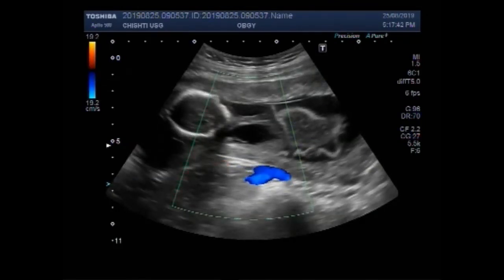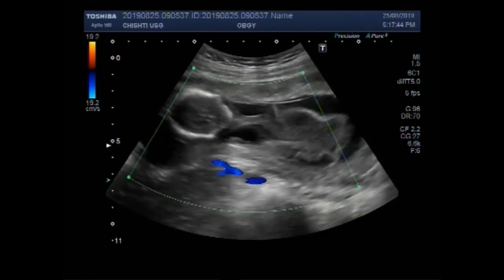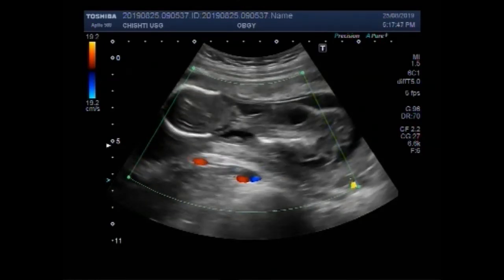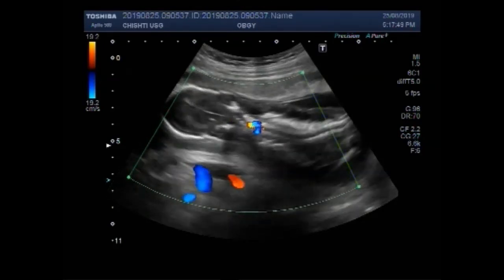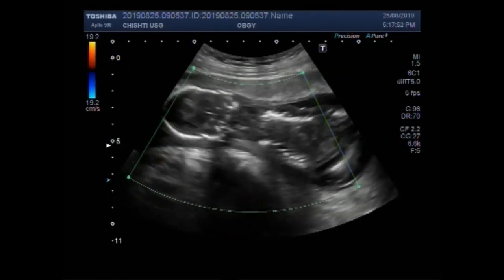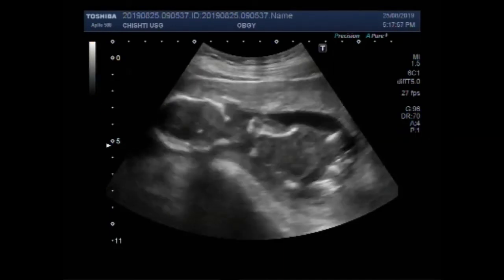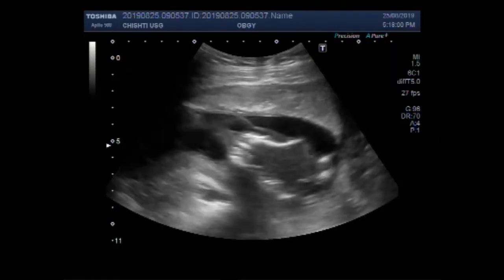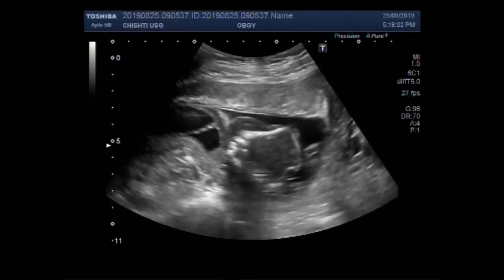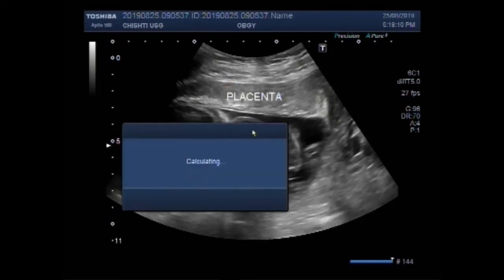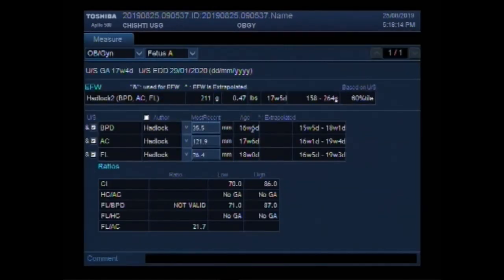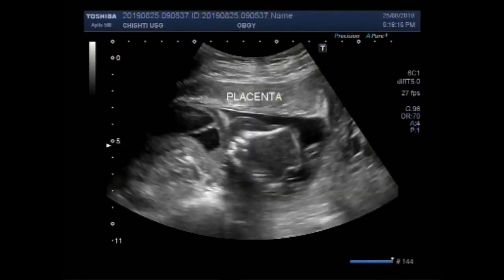There is no blood flow seen inside the fetus. The pregnancy measures about 17 weeks, 4 days.